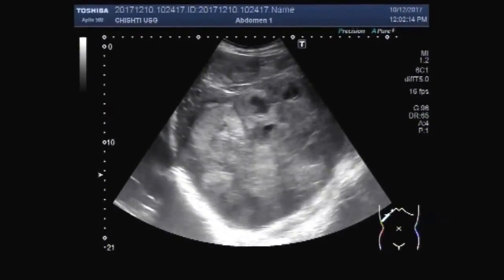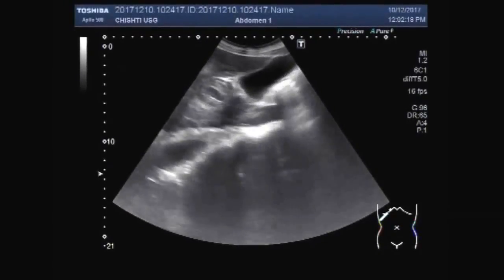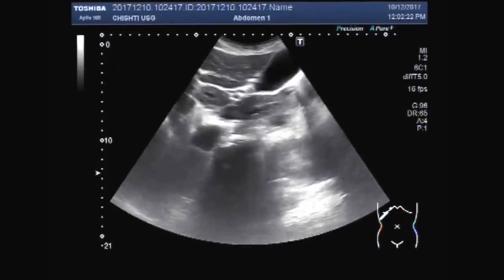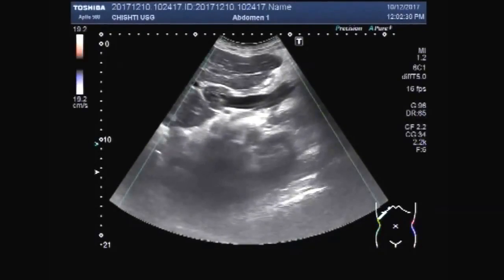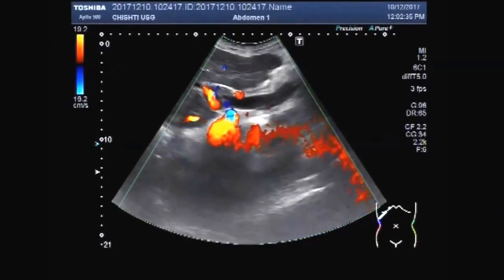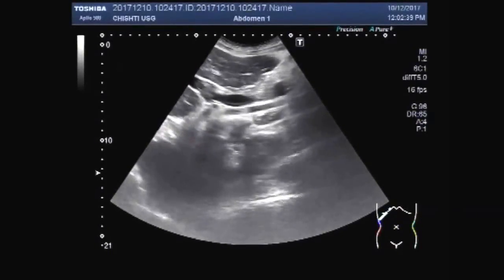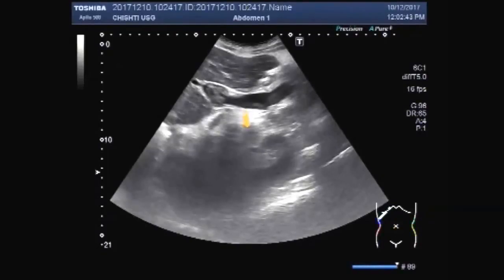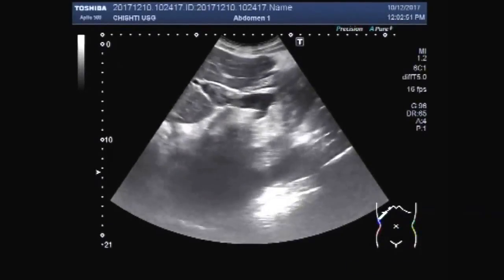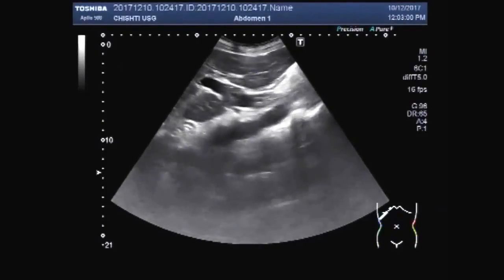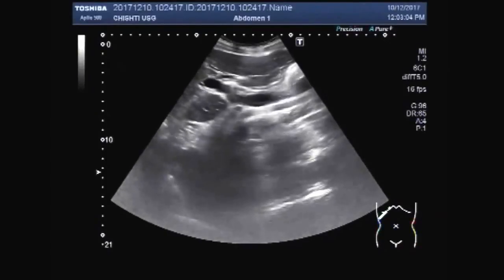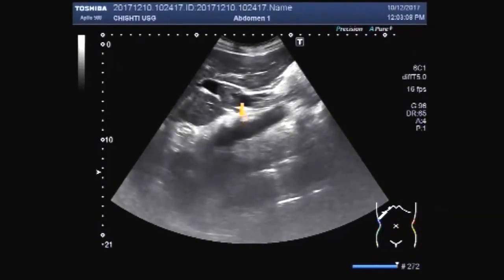You can see multiple masses. Now you can see the portal vein, and a thrombus is seen in the portal vein. This is the portal vein, and this is the thrombus seen in the portal vein.